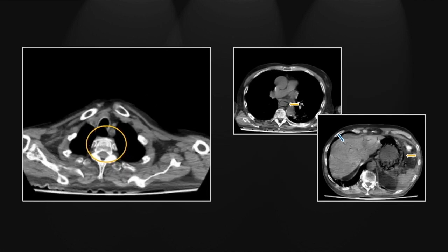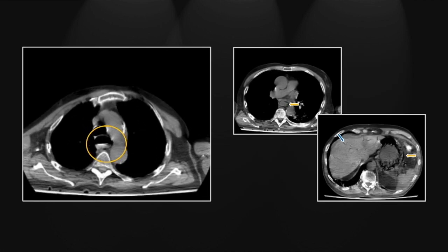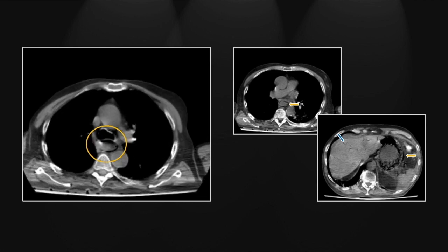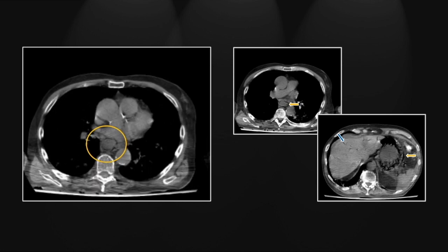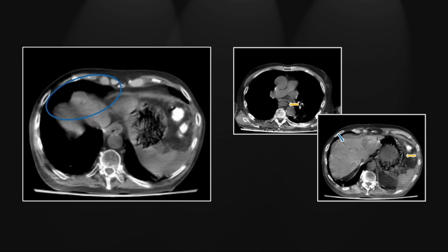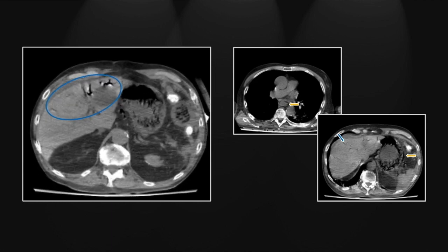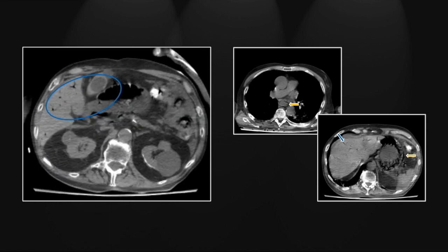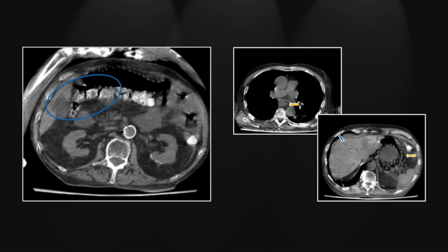Here you see the extent of the esophageal pneumatosis — a fairly unusual finding — extending down to involve the stomach as well. And here, in the peripheral liver, arborizing gas collections consistent with portal venous gas.